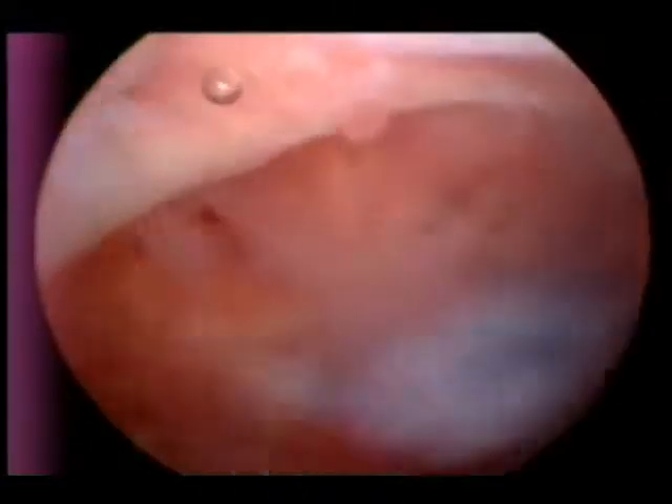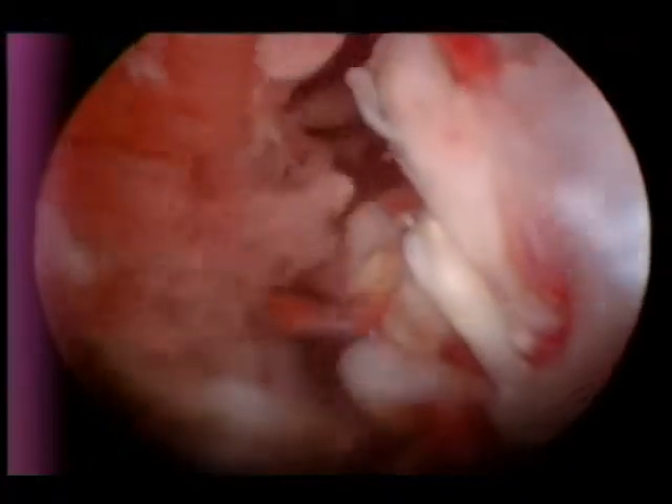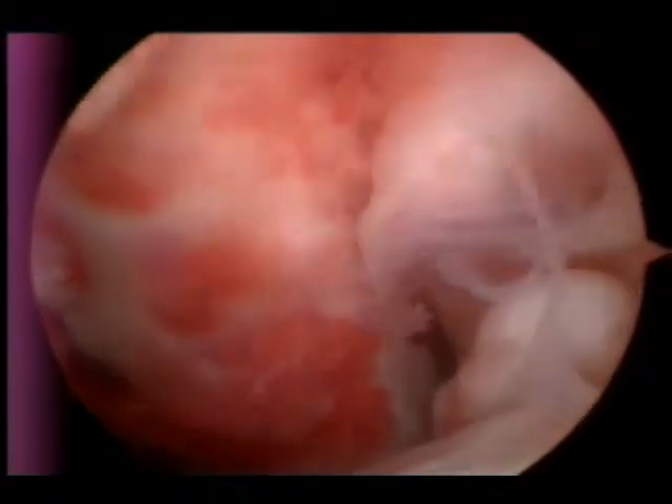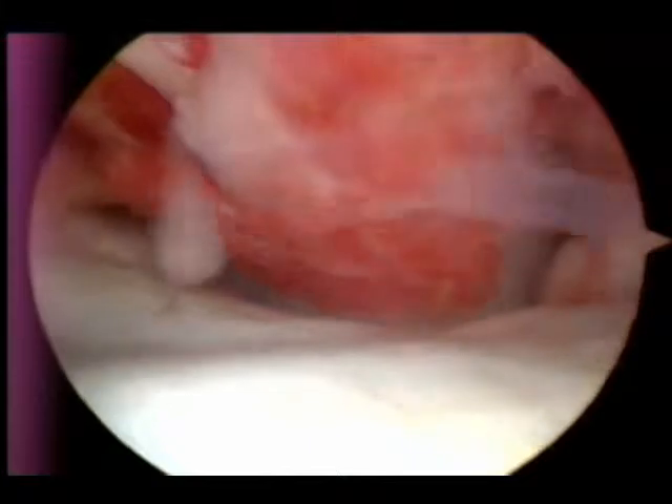This is an arthroscopic video of a canine shoulder joint with a biceps tendon tear. Right here we see the tendon with a lot of reactive tissue around it, and there's the tendon as it goes down through the bicipital groove, with a lot of reactivity around this torn tendon.